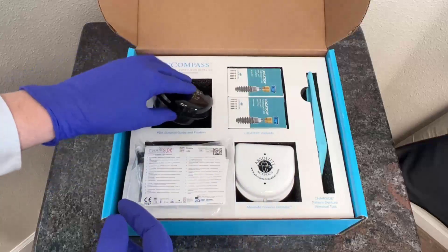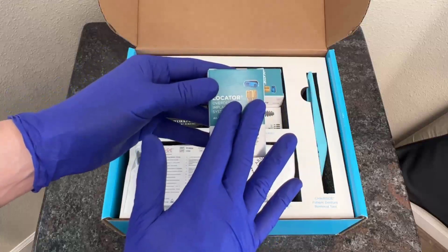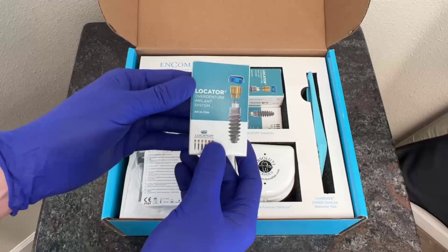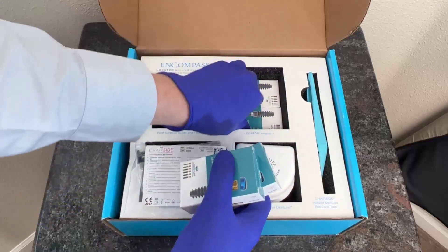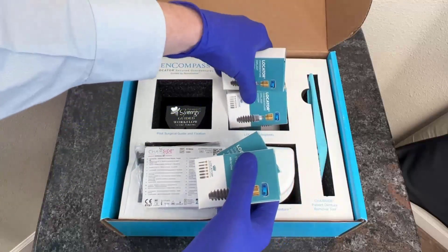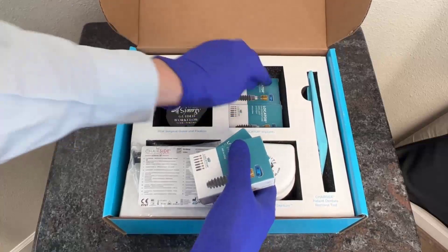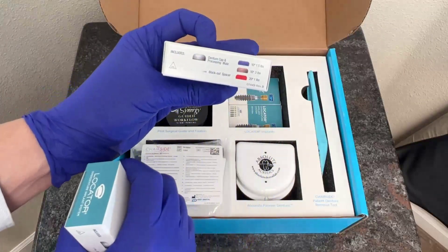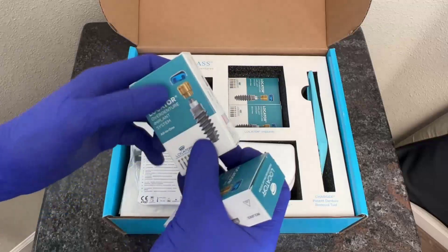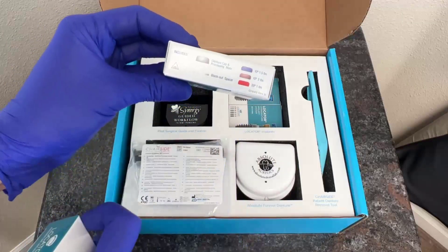The surgical plan also includes the dental implants. All of the dental implant sizes included in our Encompass box are already on the prescribed information sheet from Encompass, Absolute, and Navigation Synergy team. We'll see here that we have our four Locator Overdenture Implants here at the top of the box, ready to go ahead and be worked on the day of our implant procedure. Inside the box of this Locator Overdenture Implant system is also going to be everything that we need to process the denture — meaning pick up the housings within the day of surgery or at a prescribed later date. Inside, I've got the implant as well as the denture processing insert or the housing, blockout spacer, and three different retention inserts.